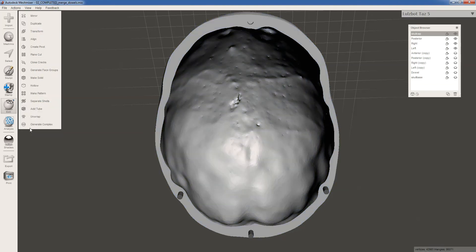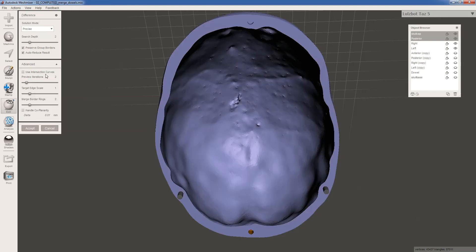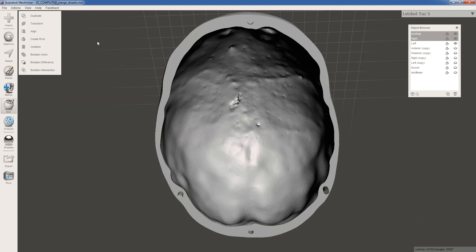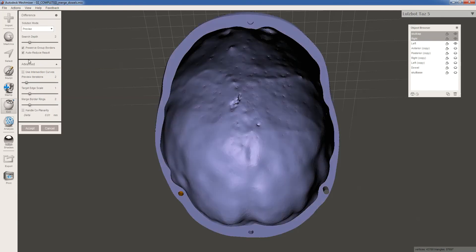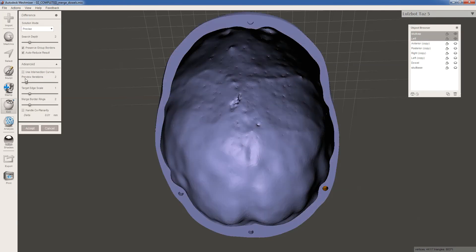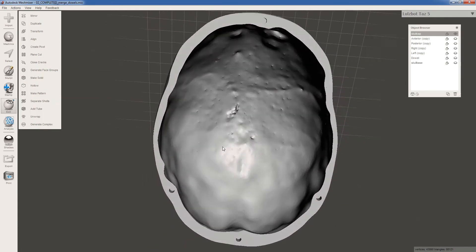Then just click accept. Basically we're going to do that for the other cylinders. I'm going to subtract the posterior cylinder from the skull cap — select both of them, Boolean difference, we have a hole there, uncheck auto-reduce result, and accept. Again, select skull cap and right, Boolean difference, uncheck auto-reduce result, and accept. And skull cap and left, Boolean difference, accept. Now we have holes in our skull cap.